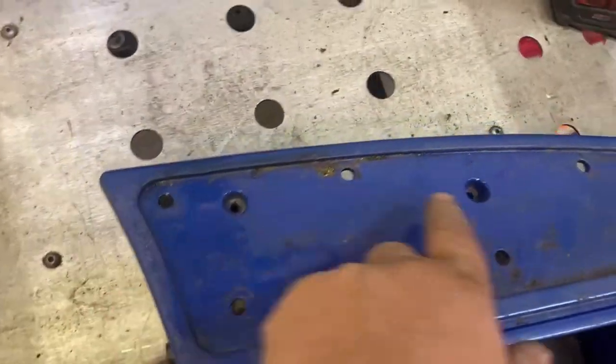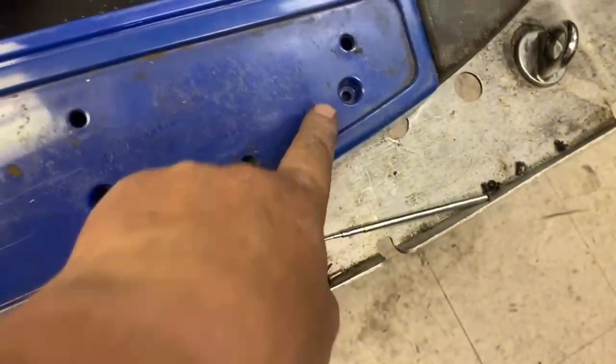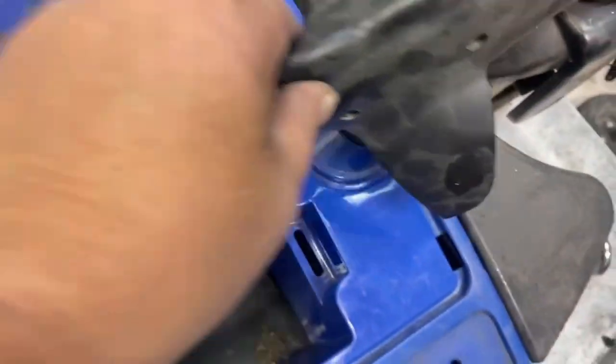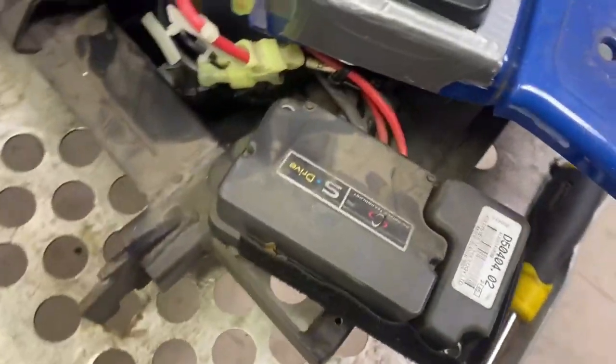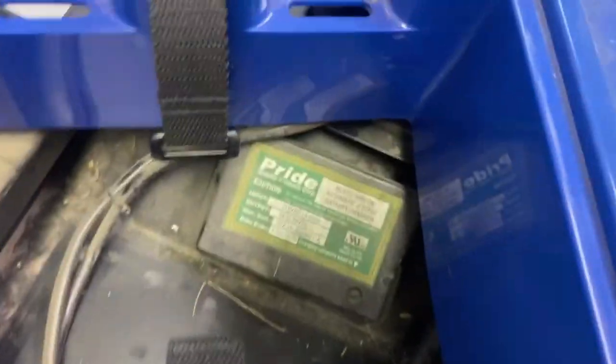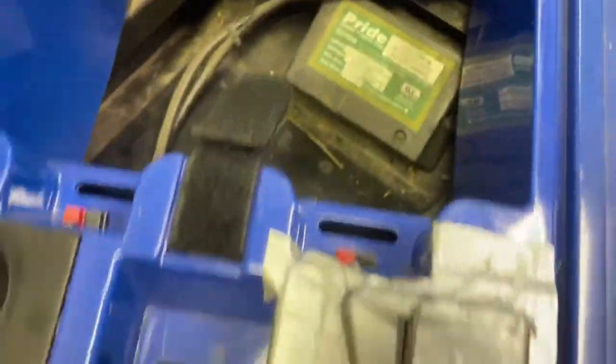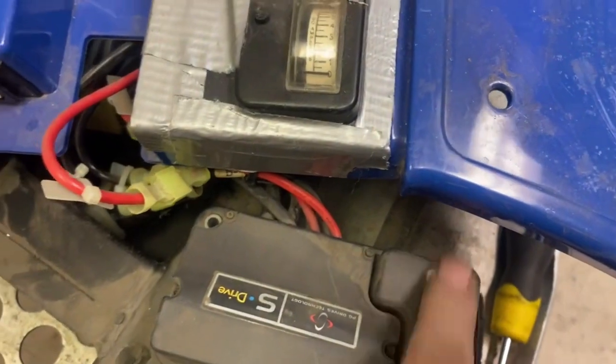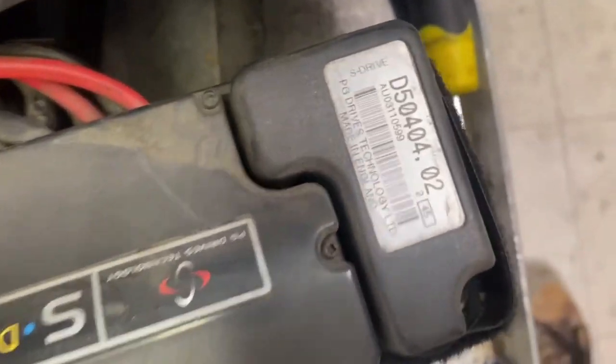Okay — one, two, three screws that side; one, two, three screws this side, covered by the rubber floor mat and the front cowl that covers the wire up to either side. Easy to do — remove that. Oh, there it is: your controller. That there is your charger, all wired up there, and this is your controller: S-Drive controller, made in England.